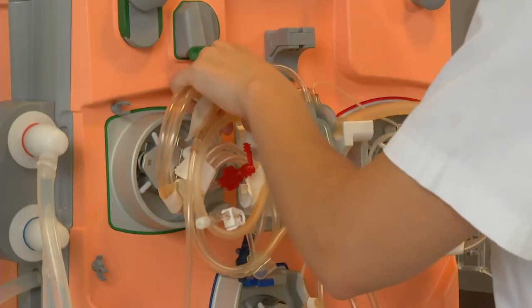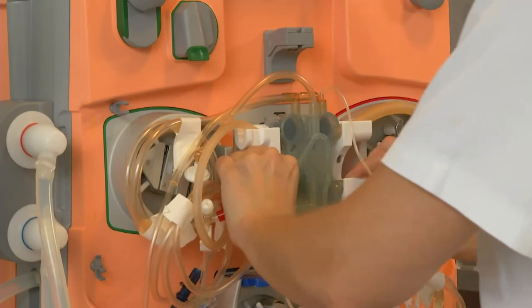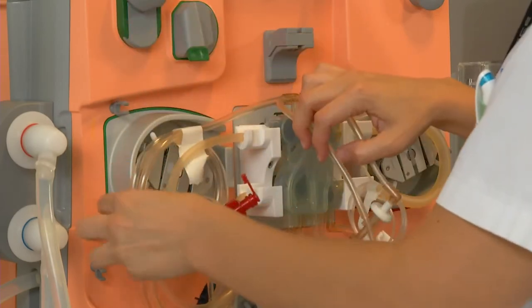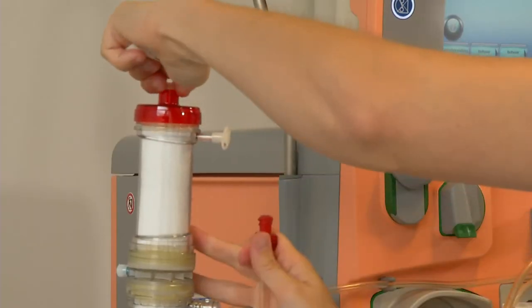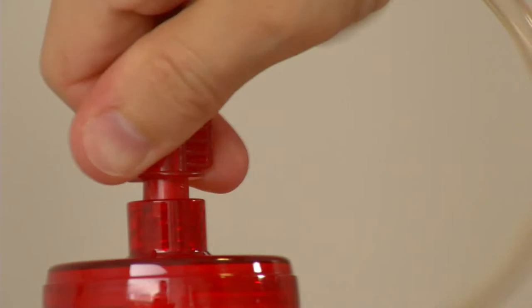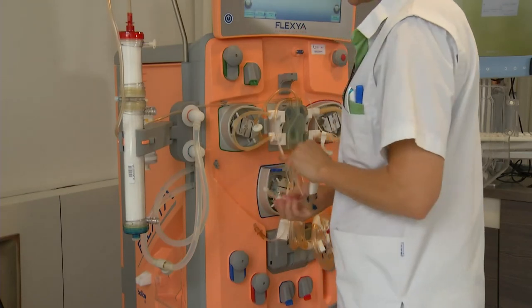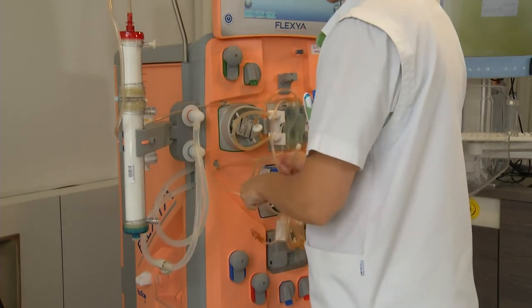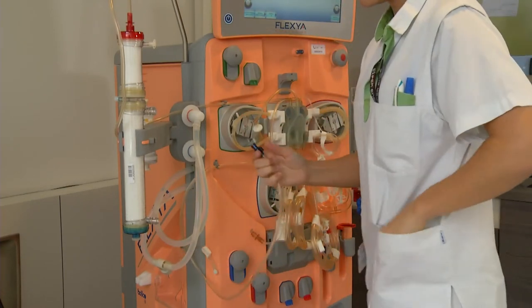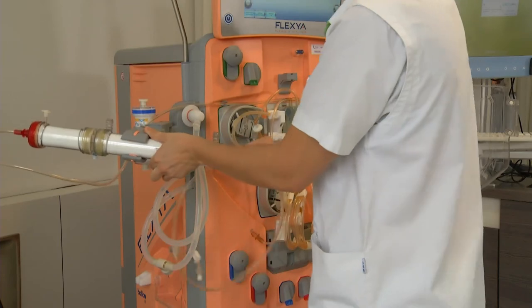The cartridge is placed into the holder. To avoid alarms during installation, it is important that the cartridge is firmly pressed into its holder. The arterial line should be in the upper chamber of the dialyzer. This is the part where only convective transport occurs. The venous line must be connected to the lower chamber of the dialyzer. This lower part is used for diffusion as well as for ultrafiltration.